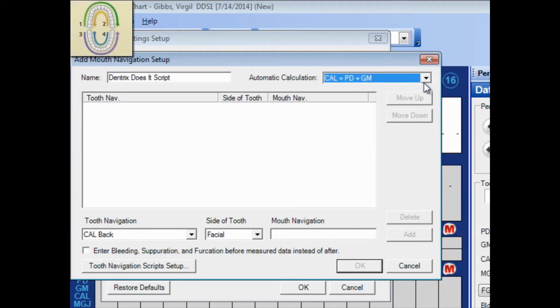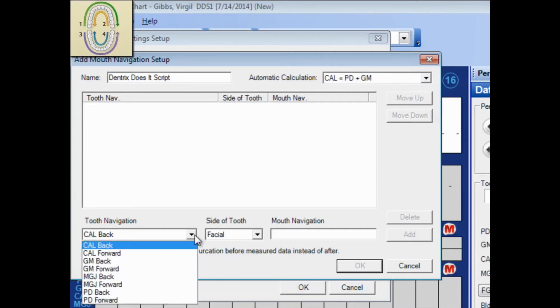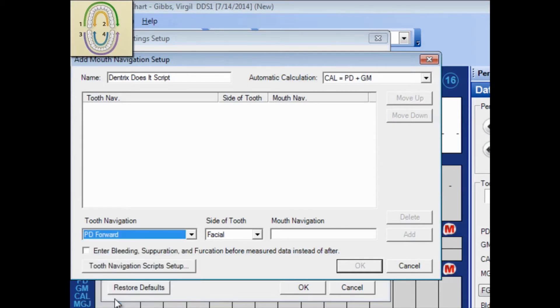And now here's where I reference my drawing from earlier. Part number 1 of my drawing is going to become line number 1 of my Perio script. I'll choose what I'm charting here, which is probing depth. I'm moving in a forward motion, or left to right. As you'd read a book from left to right, that's forward in the terminology of Perio.